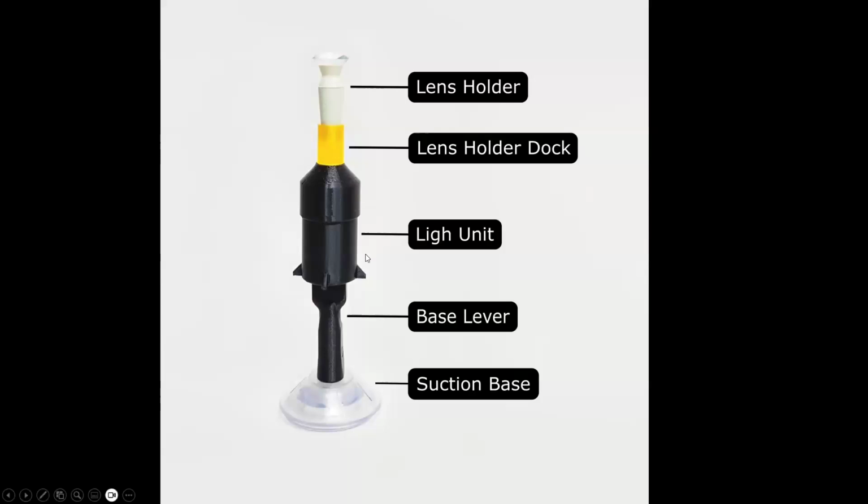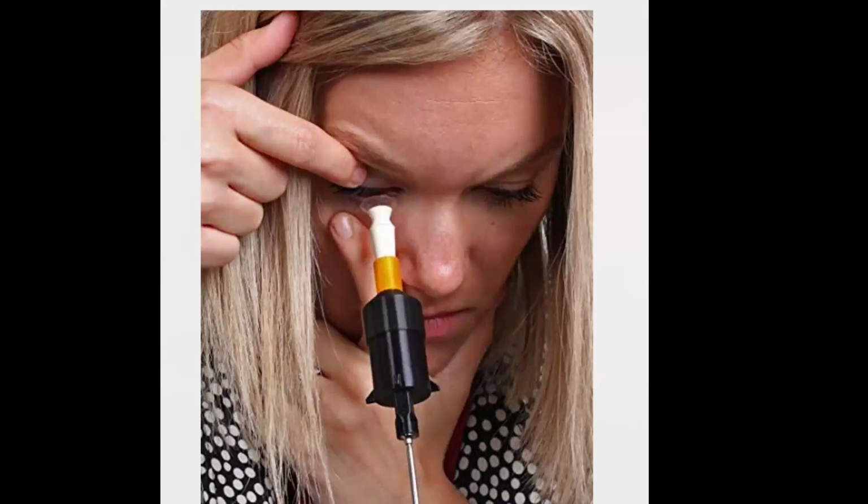With the lens holder, you just station the holder on the floor, and you ask the patient to station the lens holder, put the lens on top here, put your liquid, the preservative-free solution, on it, and then bend to have your face on the same plane with the surface of the holder, and insert. So we'll see what it looks like here.